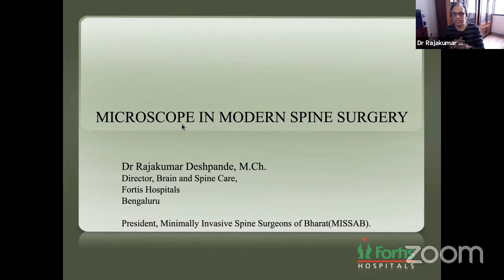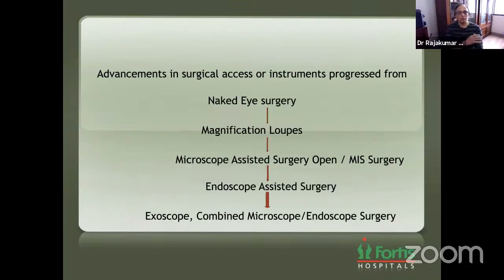My young colleague, Dr. Murali, explained some things about the microscope today. And let me add a few things around the microscope so you can understand where and when we have to use it. So the advancement in surgical access or instrumentation actually progressed from naked eye surgery.